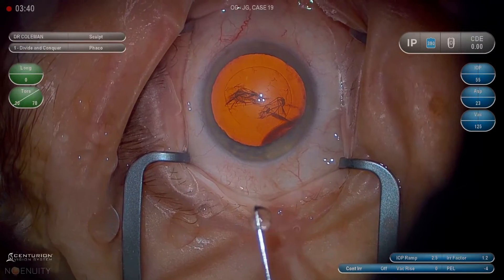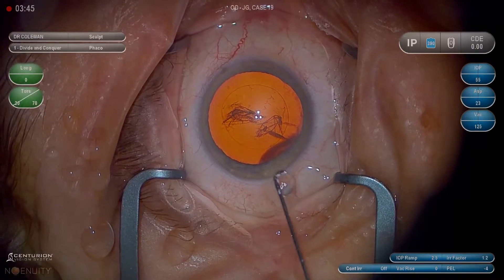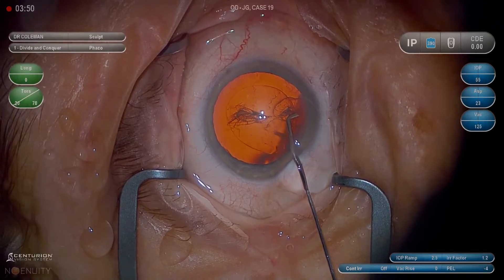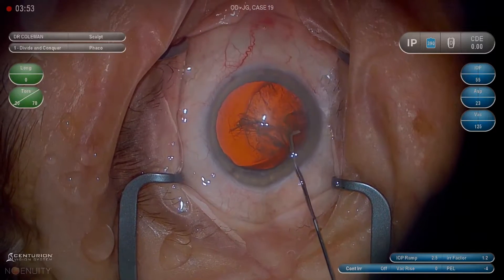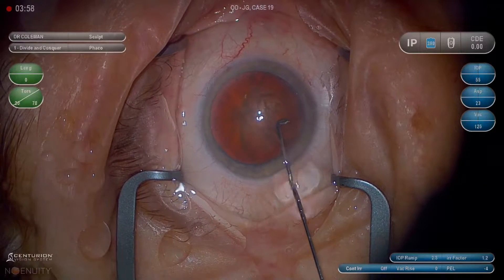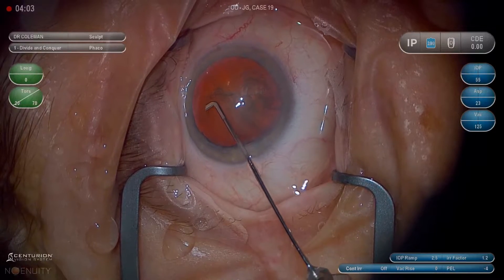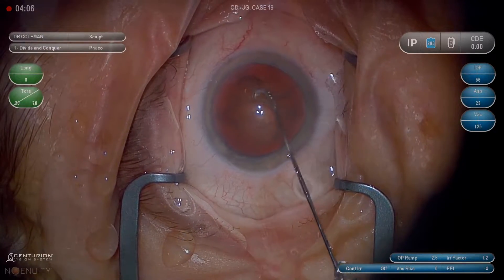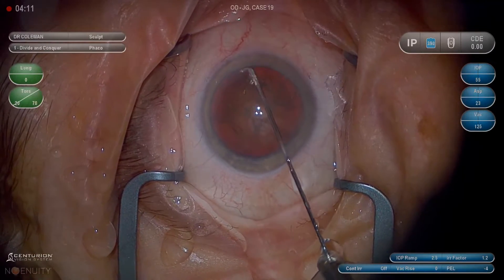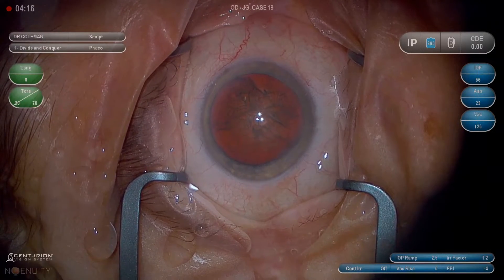For hydrodissection, I use a Chang cannula. A straight cannula is fine, but the Chang is a little bit better at getting under the wound. We want to make sure the tip is between the anterior capsular leaflet and the cortex, and not between nucleus and cortex. I don't think hydrodelineation has much value. Hydrodissection is about high pressure and low volume — pulses of high pressure. High volume is what burps the lens into the anterior chamber and prolapses the iris through the wound. So high pressure and low volume in small pulses is the key.